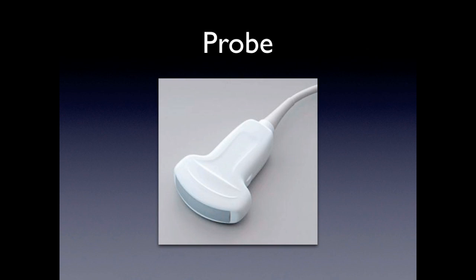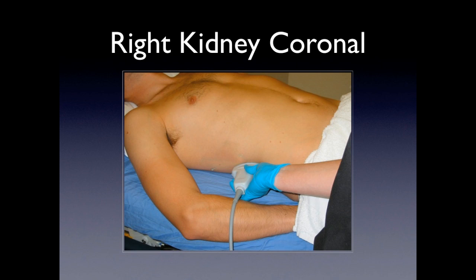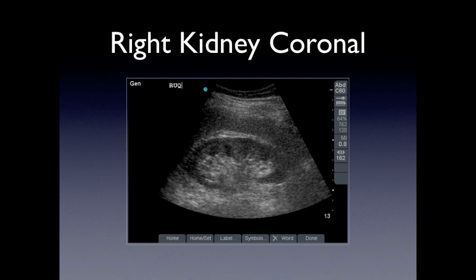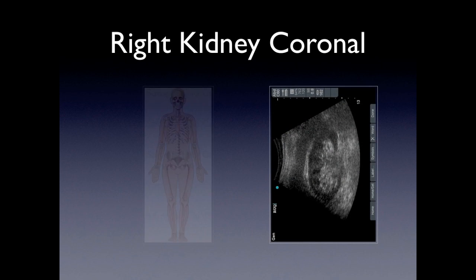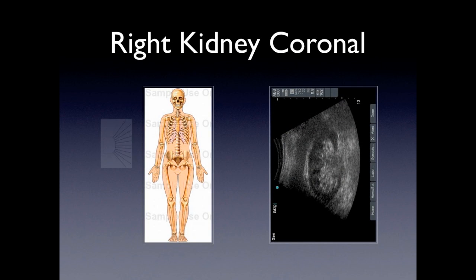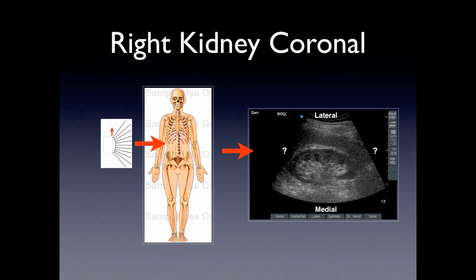We're going to be using the curvilinear probe at the mid-axillary line, with our indicator pointing towards the patient's head. Regarding orientation, your probe is on the top part of the screen in your near field. So if we orient the patient towards the image, you might understand a little better — don't worry about it too much if not.